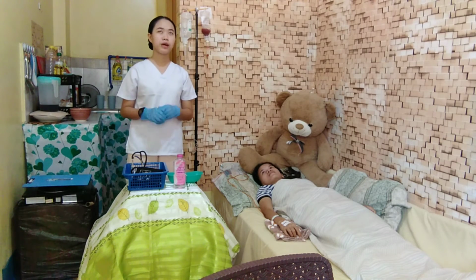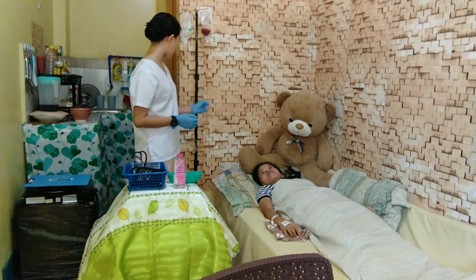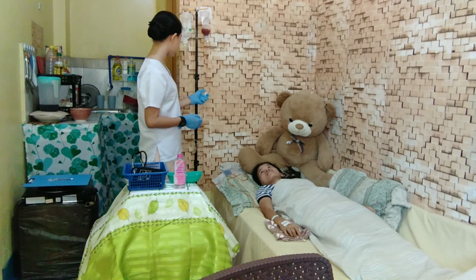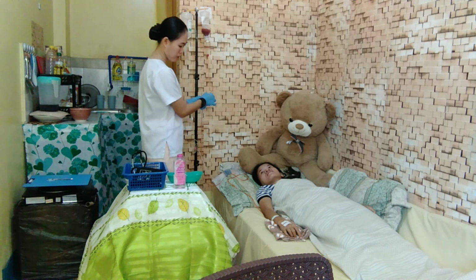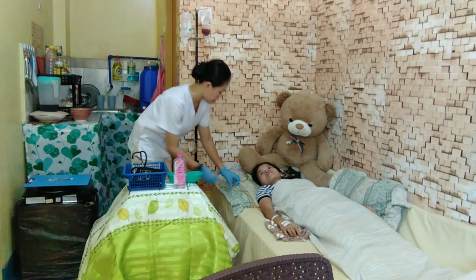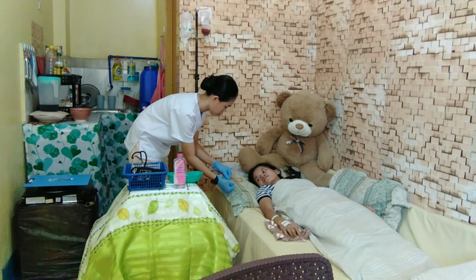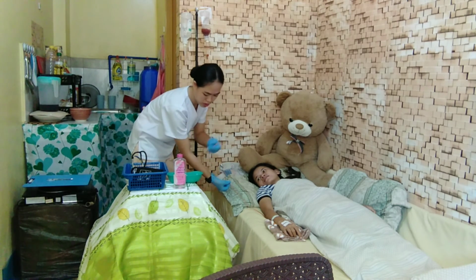Assuming that the blood transfusion is done after 4 hours, we will remove and dispose of the gloves properly and wash our hands. We will lock the roller clamp for the blood transfusion first, and remove the connections and clean.